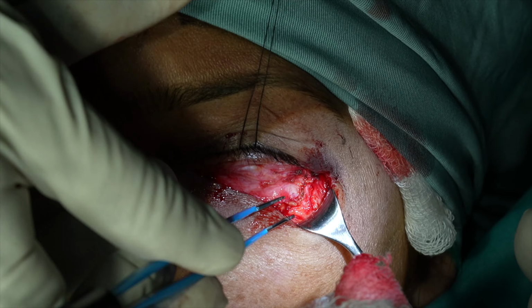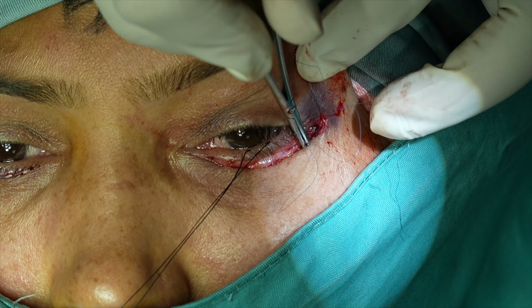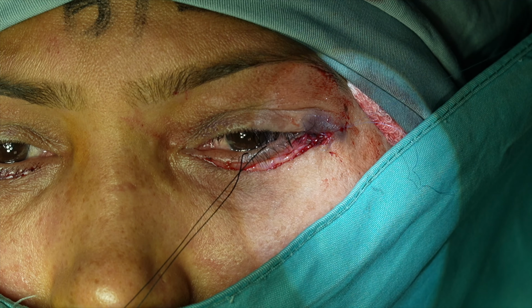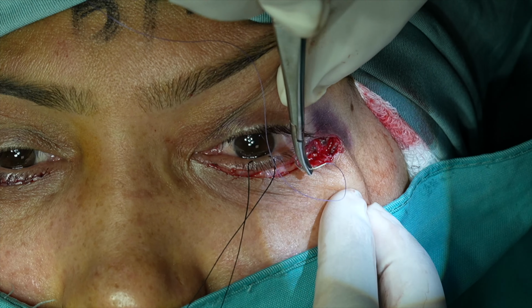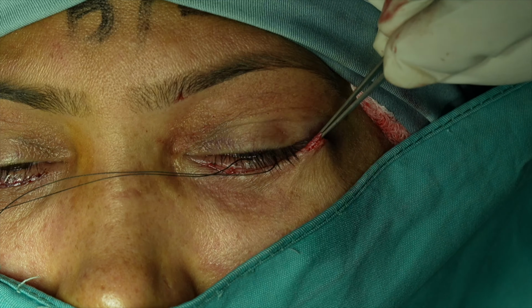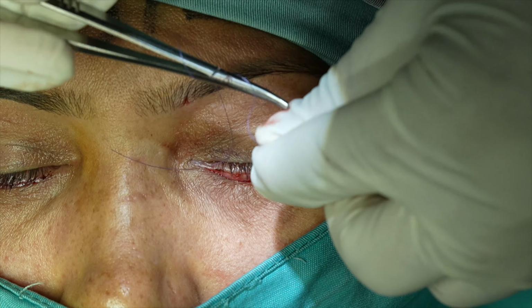Ensuring the hemostasis, the septum is tightened with the cautery. Lateral canthopexy is performed as on the right side. And the incision is closed with Vicryl suture.